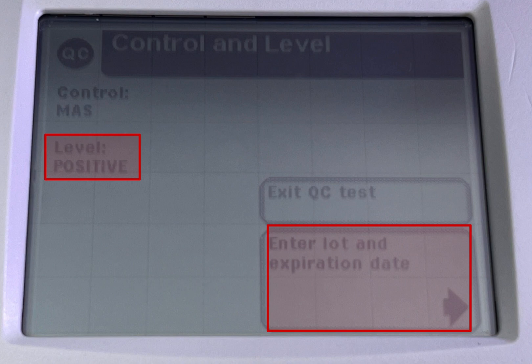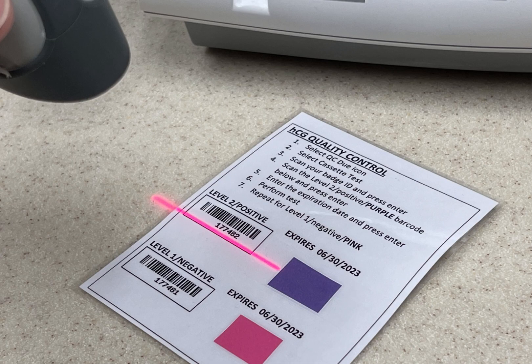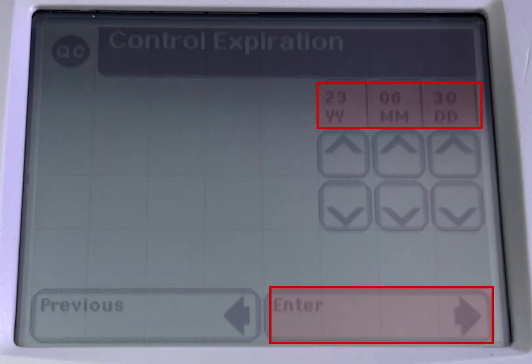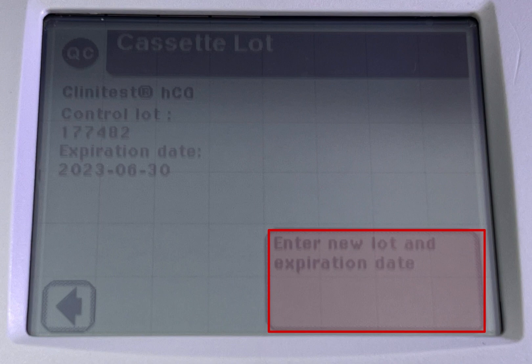Level positive. Click on enter lot and expiration date. Scan the positive QC control lot barcode on the card. Click enter, then add the expiration date and click enter.